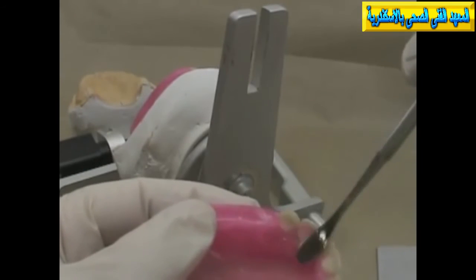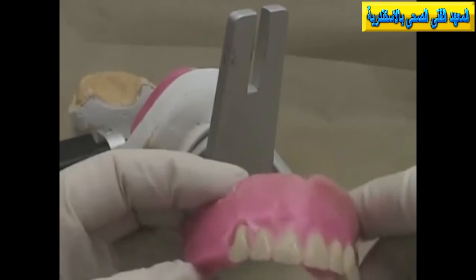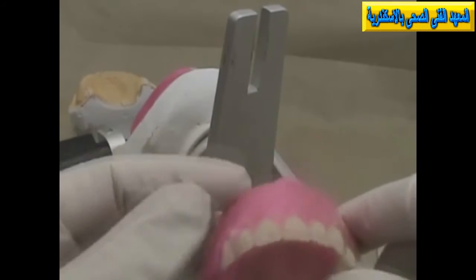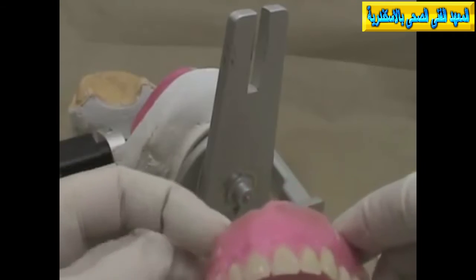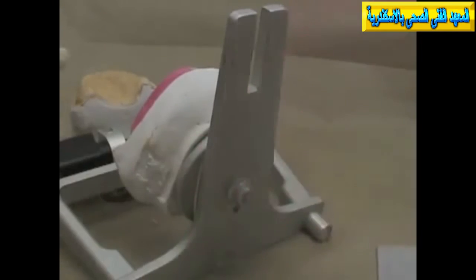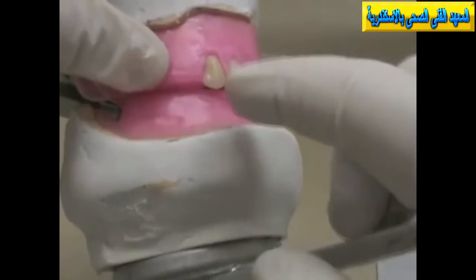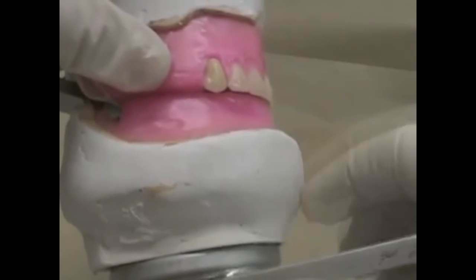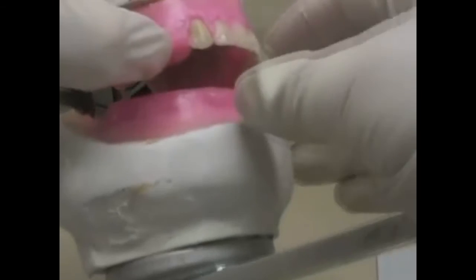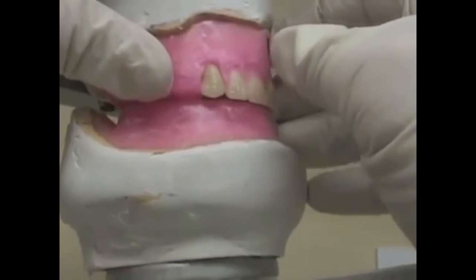We'll soften that wax and blend it in with those teeth. Try not to get too much wax on the teeth at this point because we're going to be having to clean that off later, and it makes it a lot easier to move teeth and set teeth if there's not a lot of wax on them. So you can see here that I've got that slight distal inclination of the canine tooth. It's probably maybe a little bit down too far, so I'm actually just going to push it up a little bit into the wax, a little bit more, so it's not down too far.